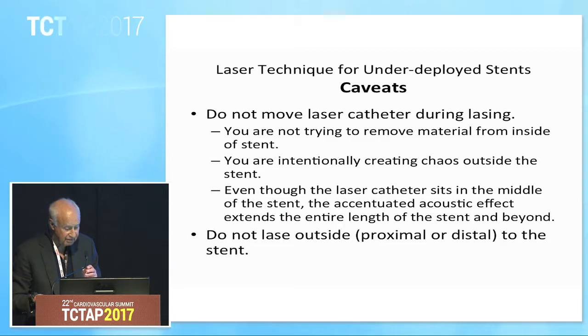This technique looks easy to do, and at least in the case of the 2 cases I showed you, very successful. Obviously, I picked the best cases, but it's very important in doing this technique not to move the laser during lasing. You're not trying to remove material from inside the stent, but rather you're trying to create chaos outside the stent. Even though the laser catheter sits in the middle of these stents, the accentuated acoustic effect extends the entire length of the stent and beyond. Think about an earthquake. Do not lase outside, proximal or distal to the stent.